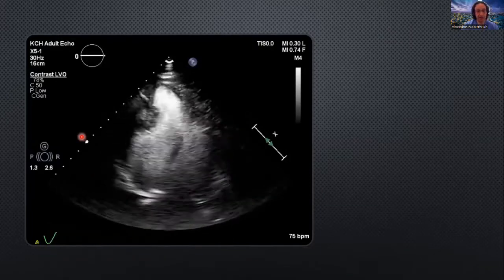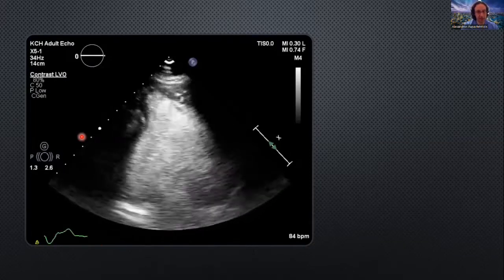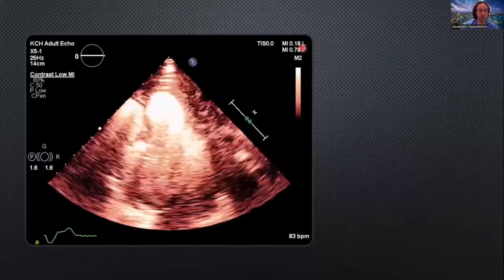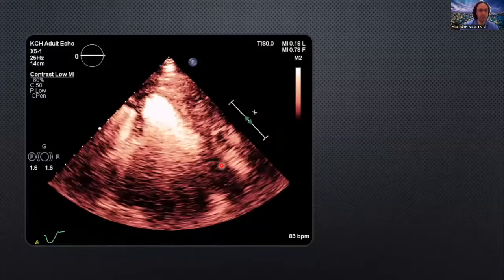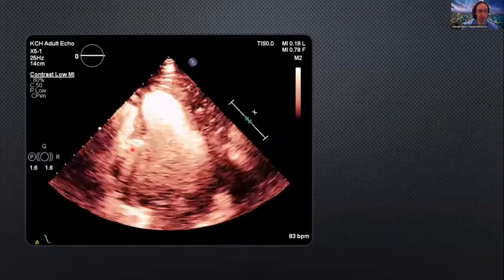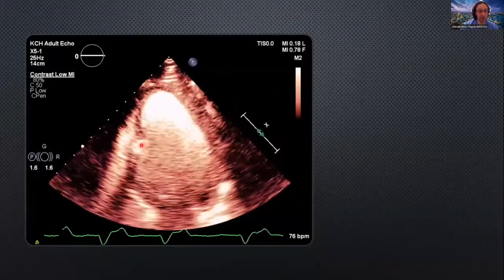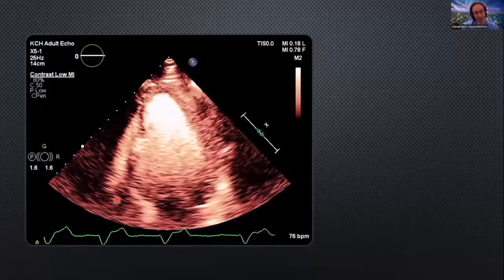but I think that this is a thrombus. Trying to view this from different angles was not particularly helpful. Change the settings, went to lower my setting with index 0.18. The focus probably could have been a bit lower here, but again, you see the scar interfering with a lot of shadowing, and again, it's not particularly helpful. Yeah, again, a lot of shadowing from the scar. You see how the shadow goes through the myocardial wall. And I had a feeling that this is an artifact.